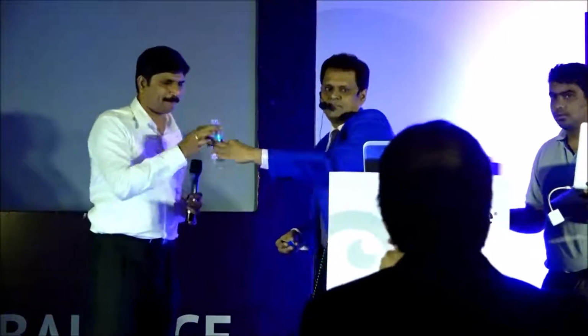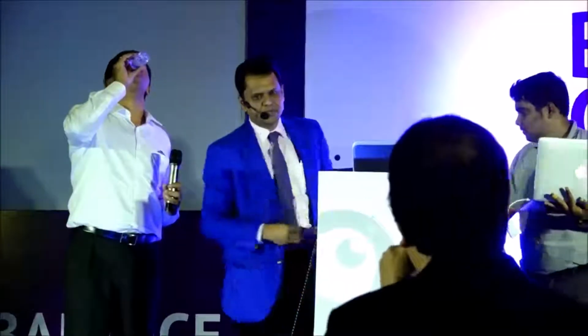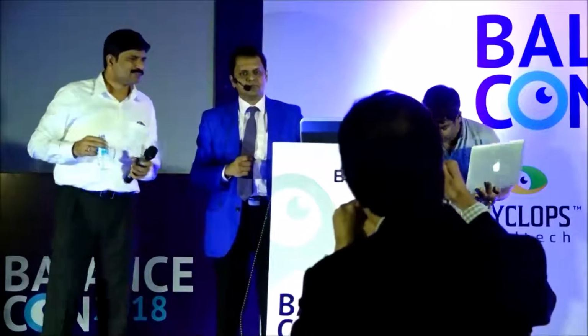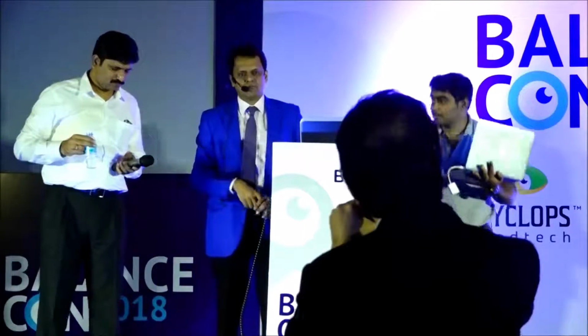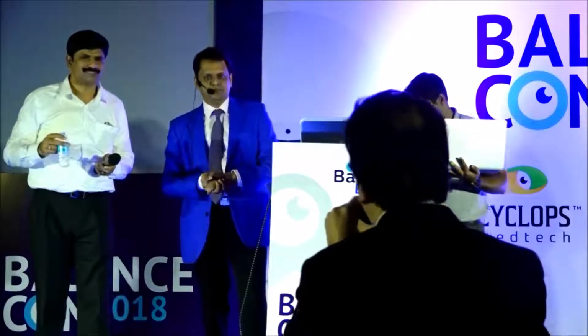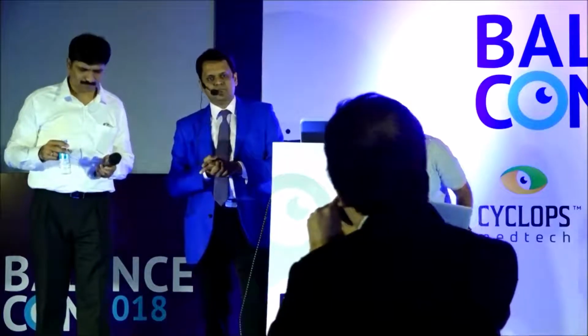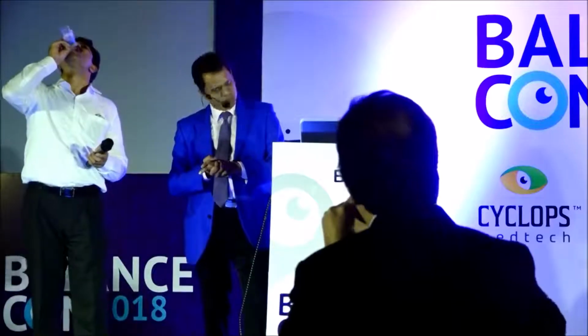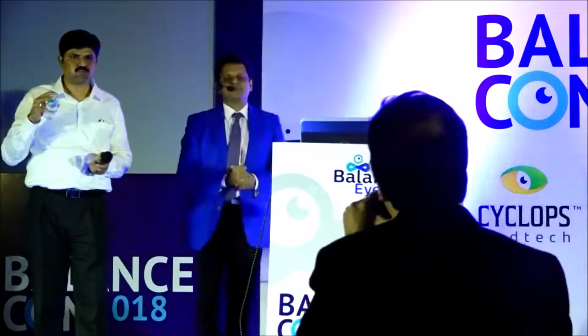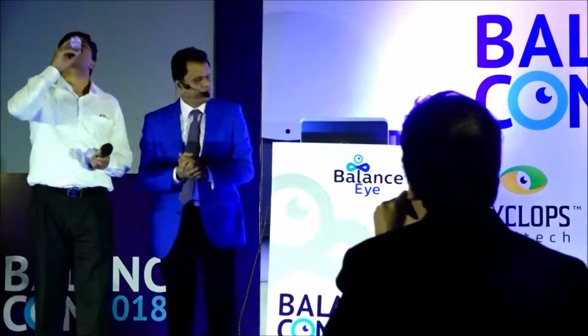Manoj enjoyed that presentation. Sunil Dutt here from Bangalore. Two questions I had very specifically. Slice thickness on your CT, you said sub-millimeter, 0.6? 0.5. Absolutely. That's fantastic. And what about 3 Tesla MRI? Will that do better than going for gadolinium enhancement? No, sir.